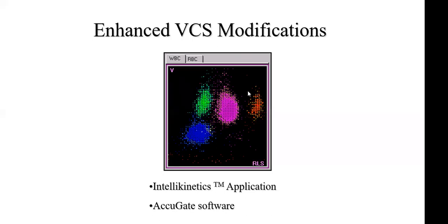Now, what is this orange population? Anybody? What is this orange population, a population which has the highest scatter? Yes, it is eosinophil. Why? Because you can appreciate those big granules inside the eosinophil, and those granules are causing more scatter. So the highest scatter is of eosinophil. This I have shown you as an example of scatter plots which are generated with the help of various techniques.